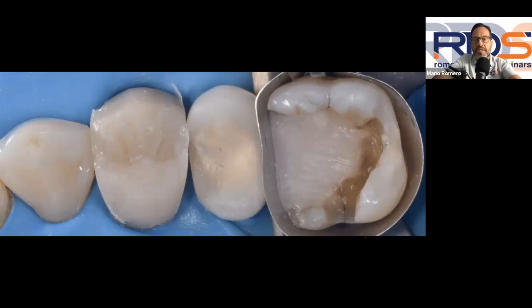All you have to make sure that you do is that you have to create a lot of pressure with the wedge. You can see my wedge being inserted already here between the second premolar and the first molar, and I'm going to create a lot of pressure. You got to make sure that you create enough pressure to compensate for the thickness of your band. So you got to make sure that you use a large enough wedge that goes through and through, and that will create that mechanical separation between these two teeth, so that I can compensate for the thickness of the band and establish an ideal contact once I'm done with this restoration.